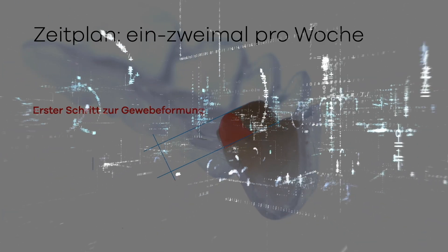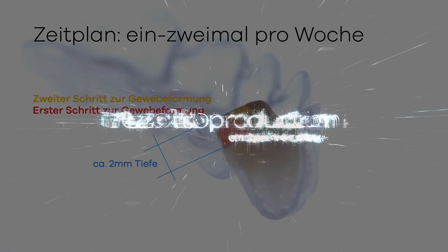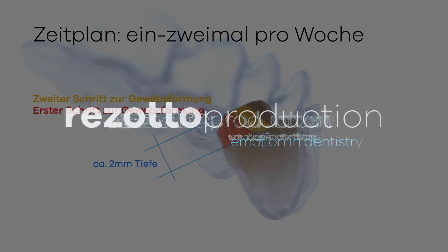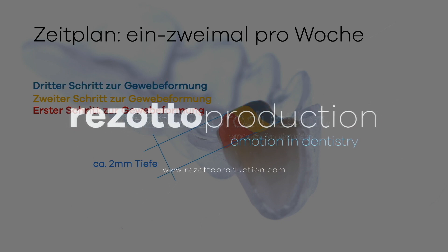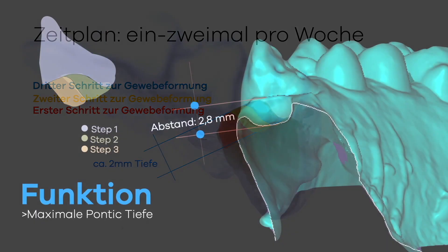Starting from the palatal with a depth of approximately 2 mm, these steps are carried out once to twice a week, until the free gingival groove and the maximum pontic depth are reached.